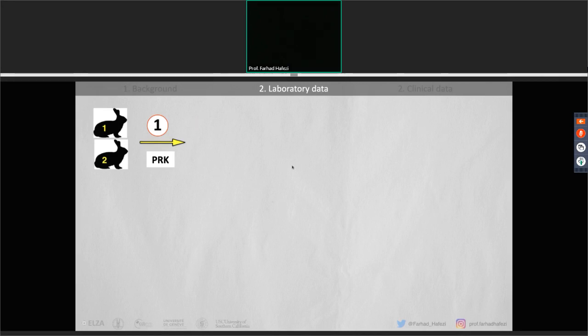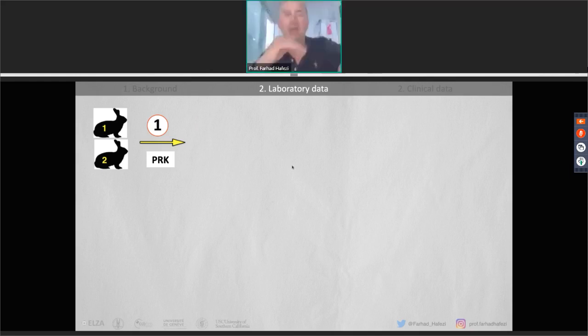And what we looked at is we spoke to Sam and told him, is there a way you give us different fluences in your ablation profile? The end result should be exactly the same as we usually have in our ablation profile, but the path from the beginning of the laser ablation to the end should be a different one with a modified fluence.